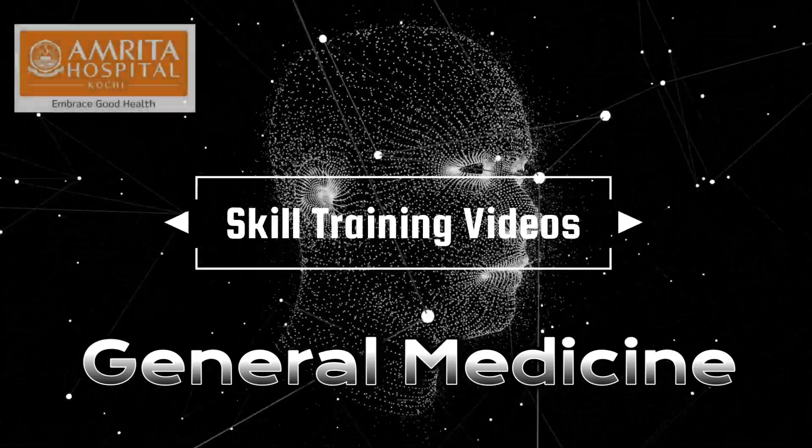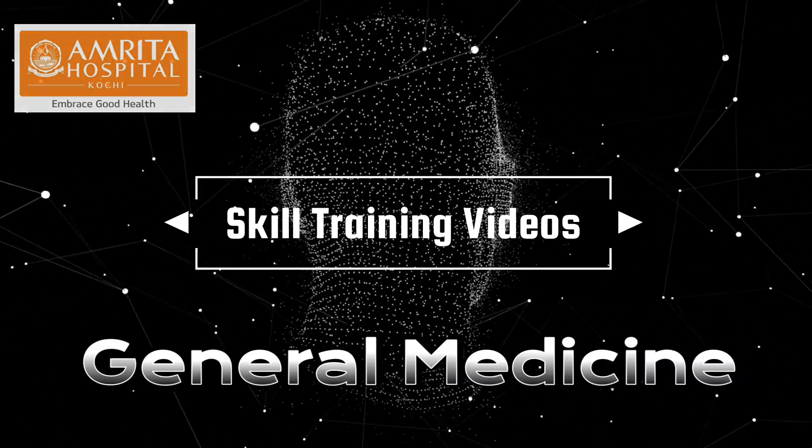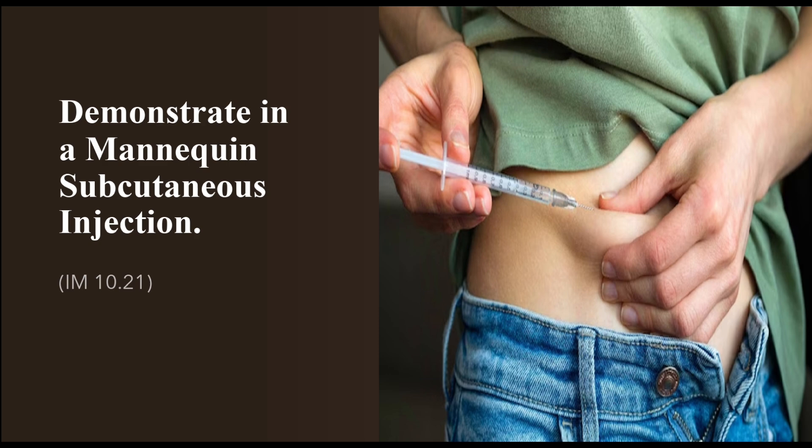Welcome to Skill Training Videos, a department of general medicine initiative. Today we are going to demonstrate on a mannequin the technique of subcutaneous injection.